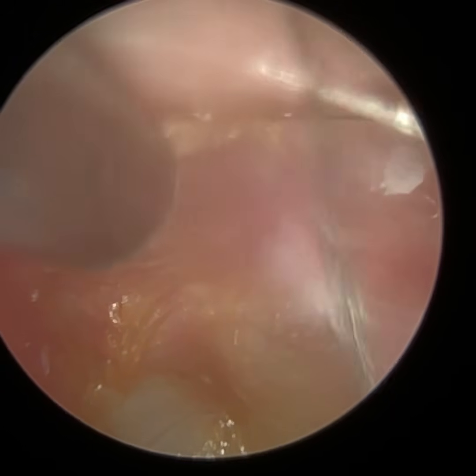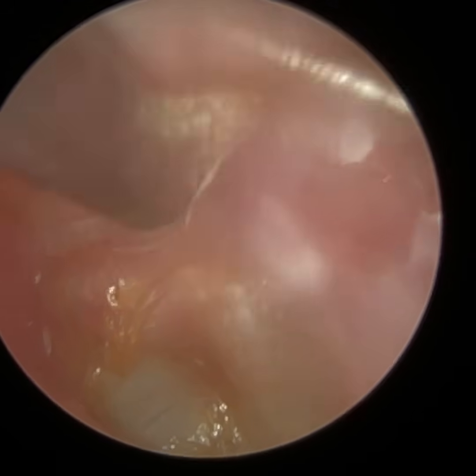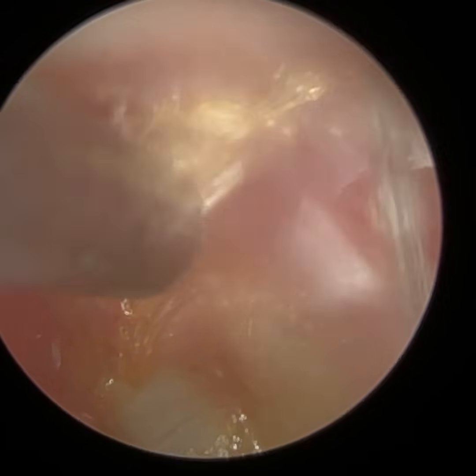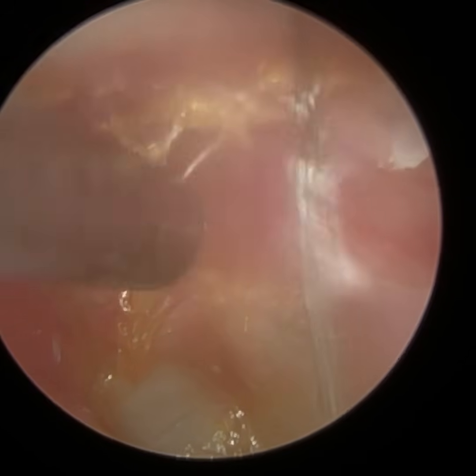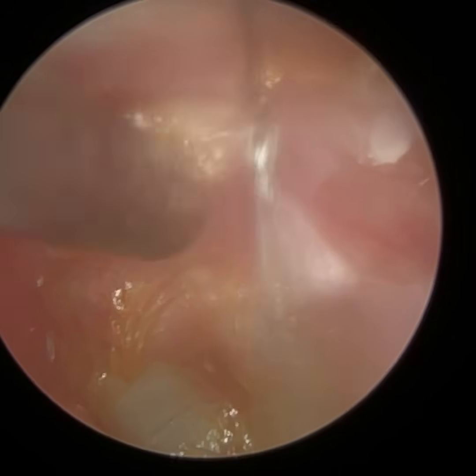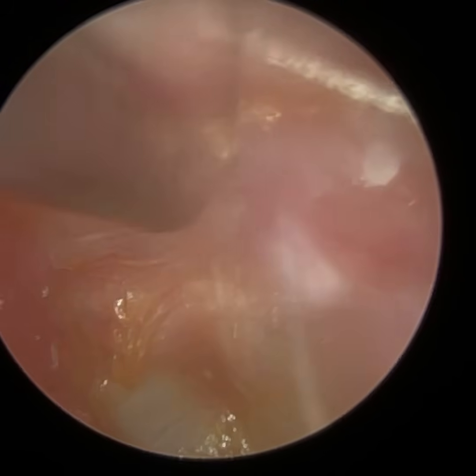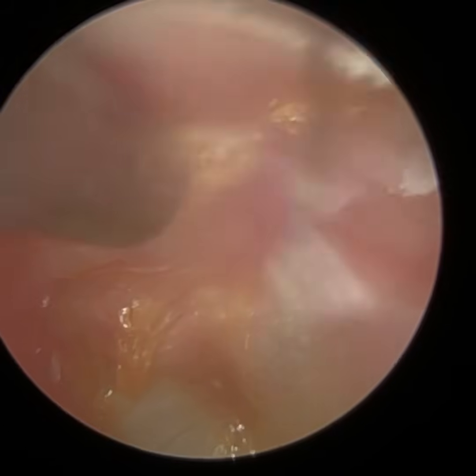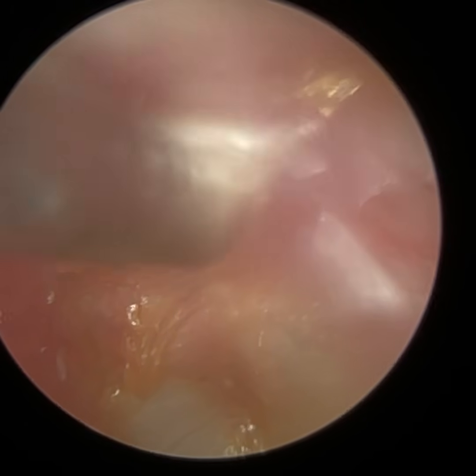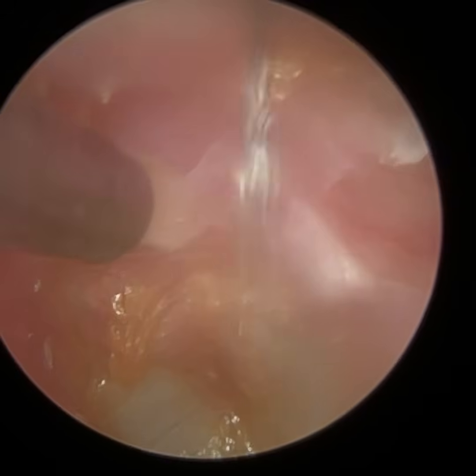Similarly with the caloric effect, you come out of the ear and you're just waiting for the ear temperature to resolve itself and your eyes to correct your brain, and the caloric effect can be soon resolved. But they did get a bit dizzy, so we just left that thinnest layer on the eardrum. It wasn't going to affect them massively. So we're just peeling some skin here from the posterior superior aspect of the ear canal. So we're slowly approaching the eardrum.